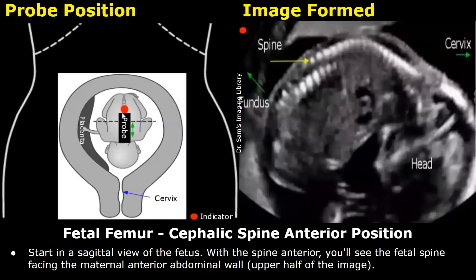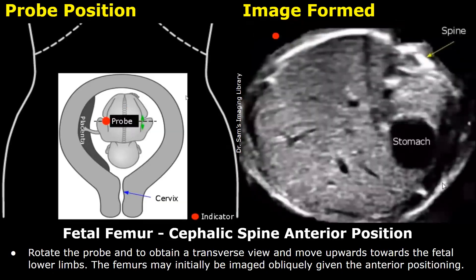This probe positioning and image formation are for a fetus in a cephalic presentation with an anterior spine position. After starting in a sagittal view of the fetus, the spine will be seen in the upper half of the image and the fetal head will be on the right side of the image. Next, rotate the probe to obtain a transverse view and move upwards slowly. This image is at the fetal stomach level — keep moving upwards slowly to find the fetal legs.